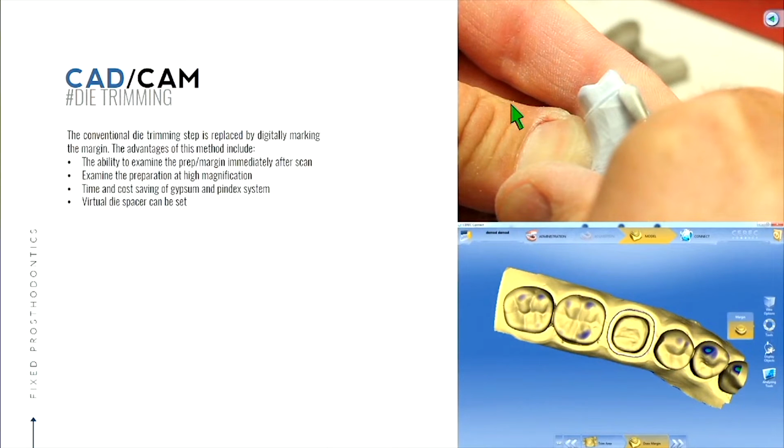All right, so once we've captured our impression, then our die trimming step, the analog way is to physically remove the stone around it with a burr, and you all experienced that last week. So in the digital method, you've all done this before, it's drawing the margin. And again, I want to reemphasize that point. It's extremely easy to trim that margin or mark that margin when you have it well isolated, and you don't have to think about, is this the tissue or is that the tooth? You're able to just draw that line circumferentially, and then you know that you're good. Okay?